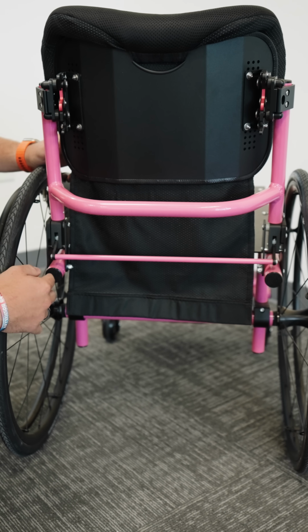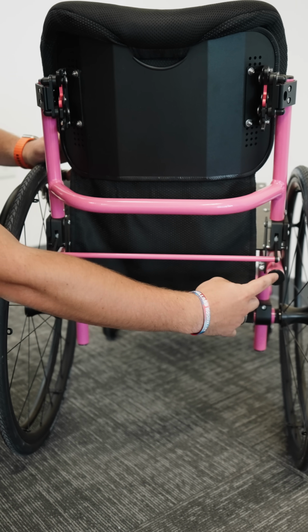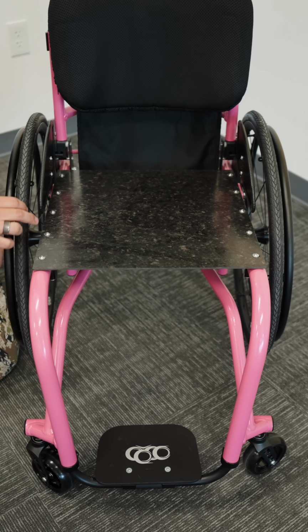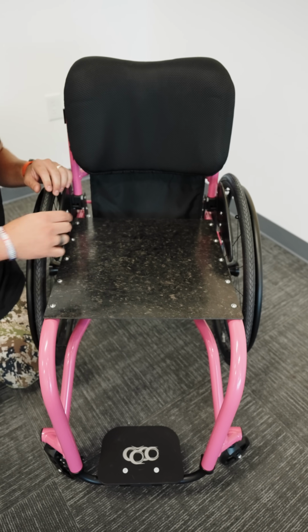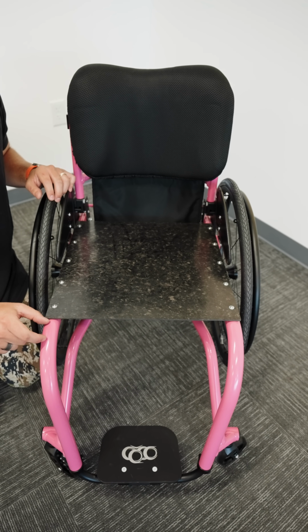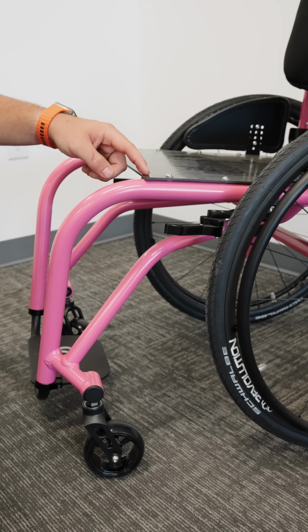The first thing that we're going to be talking about with our measurements is the measurements that are and are not adjustable. The first thing that we're going to cover is the measurements on your wheelchair that are not adjustable. Our first measurement that's not adjustable is our rear seat width, or the width between your frame rails. The next one that can't be adjusted is frame or seat tapers, and also front seat width as well. Next is our seat depth and frame extension. Next measurement is our rear wheel camber. And then lastly, we have our front angle. So those are all the measurements of your wheelchair that can't be adjusted.